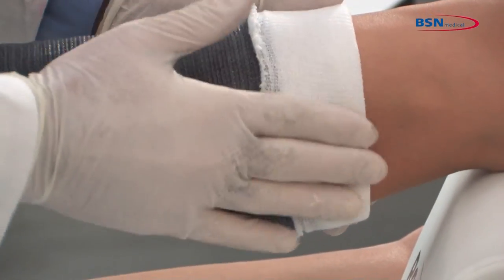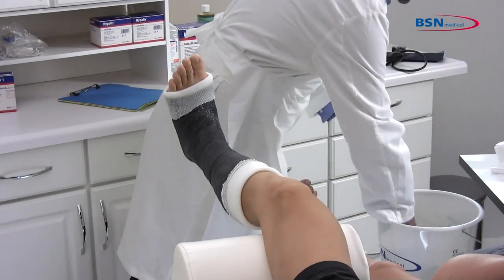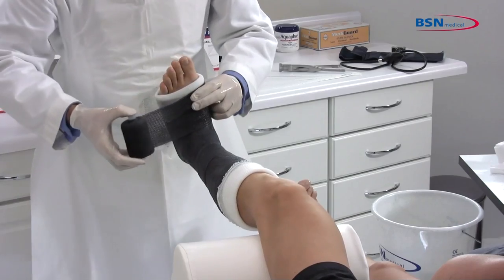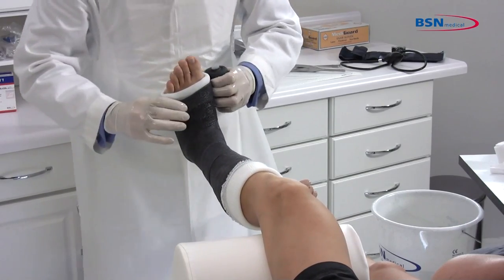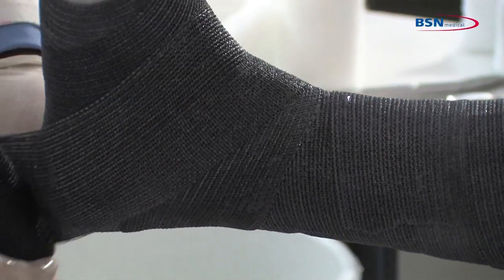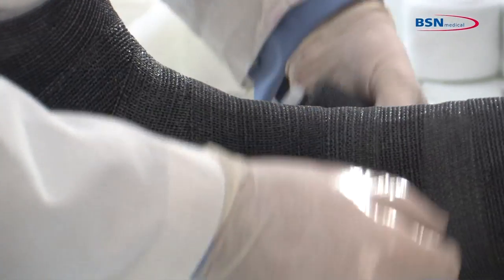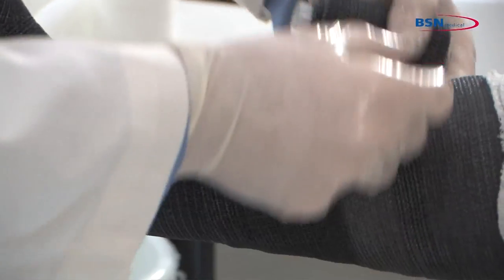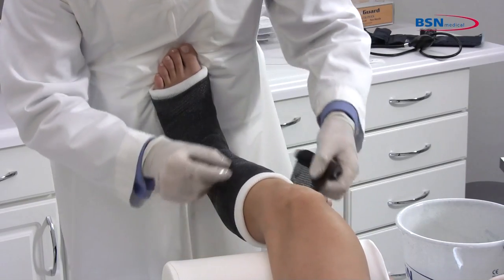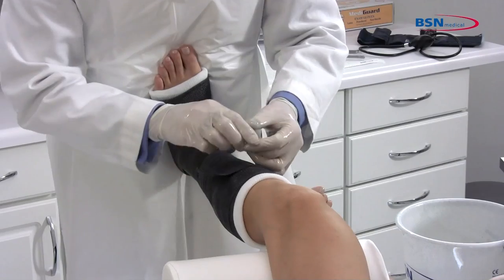Take a third roll of cast tape. Dip the cast tape in water squeezing 1 to 3 times, remove from water and squeeze 1 time to remove excess water. Start wrapping the cast at the metatarsals twice and work toward the ankle with 70% overlap. Go around the ankle and work toward the knee with 50% overlap. Be sure to stay below the fibular head and leave approximately 1½ inches of stockinette exposed to leave a soft end.